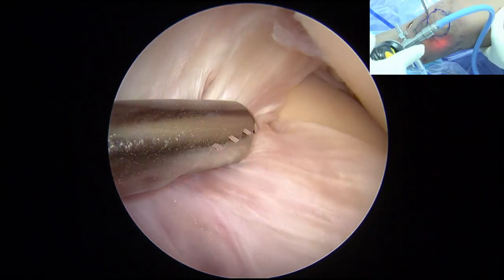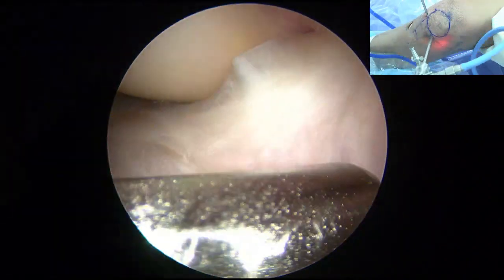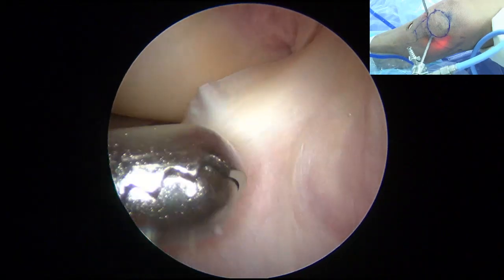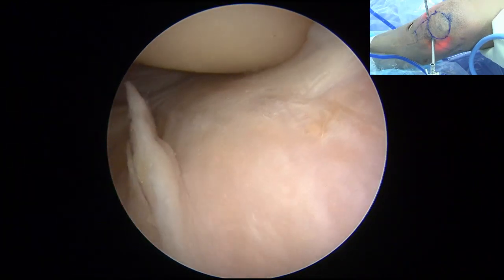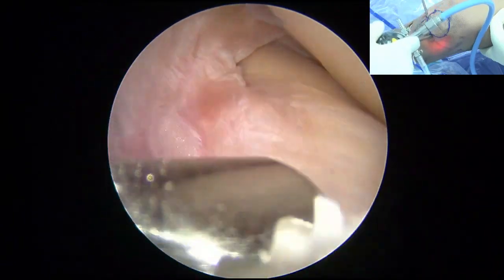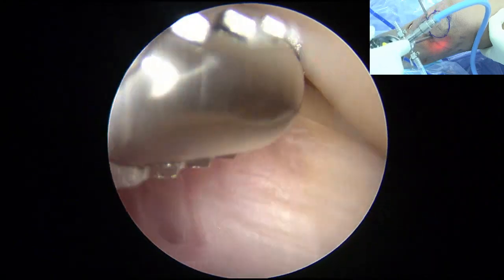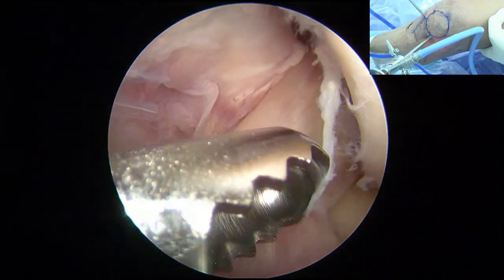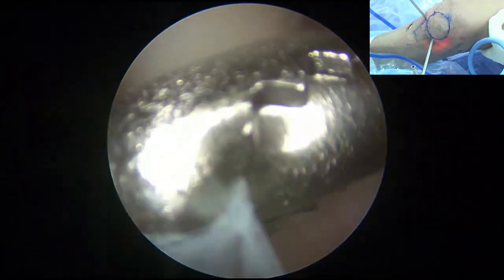When you shave the soft tissue, keep in mind, do not cut here. Many times you cut the anterior horn of the meniscus, or the intermeniscal ligament here from the medial side, connecting to the ACL. This is the intermeniscal ligament. If you are not familiar, you cut it as soon as you get in, or clear the ACL footprint. So clean the soft tissue to see well enough. We only need to clear the loose soft tissue to see clearly.